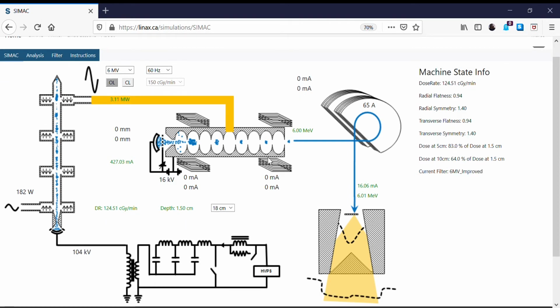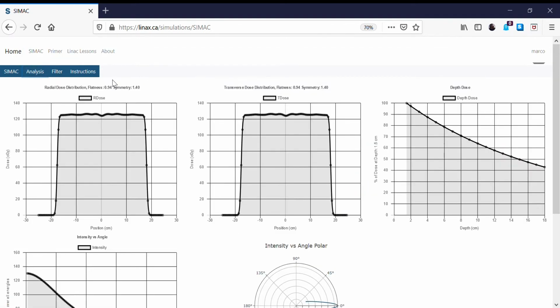So in this video, we're going to look at the effect of the beam symmetry. Beam symmetry is an important clinical property for radiotherapy beams because we want our beams to be flat and symmetric. What I have here is our 6 MV beam loaded, with the improved flattening filter for the 6 MV beam. We can see this in our analysis tab for SIMAC, where we see our nice flat beams.